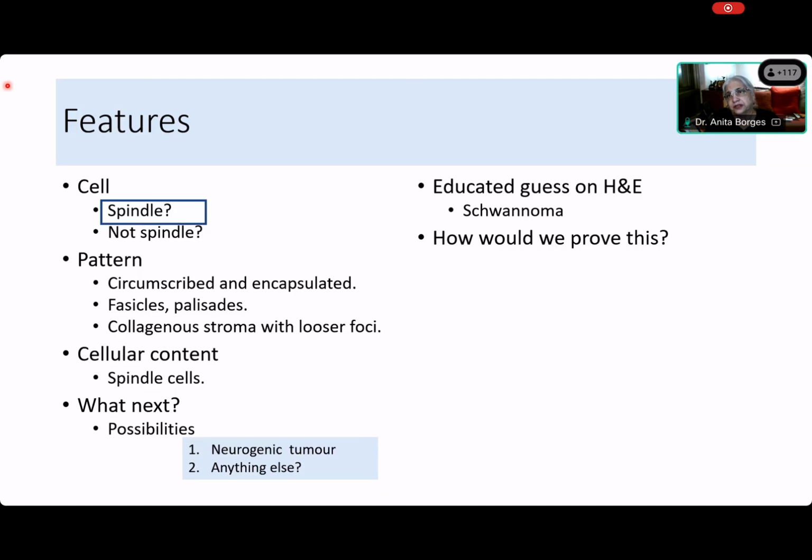Come on, Saida, what? It will be highly cellular and with increased mitotic activity. Very good. Exactly, and it should have necrosis. And there is nothing like that over here. There's no mitotic activity, there is no necrosis, and it is not highly cellular, and it is beautifully palisaded. So I don't think that this is a malignant peripheral nerve sheath tumor. Even if it was, how will S100 and SOX10 help you? It's not going to help you, no? Benign or malignant, they may still be S100 positive. So we don't need to do this.